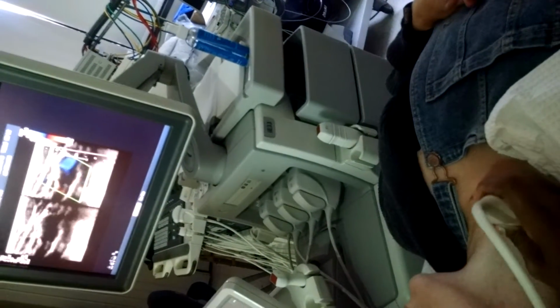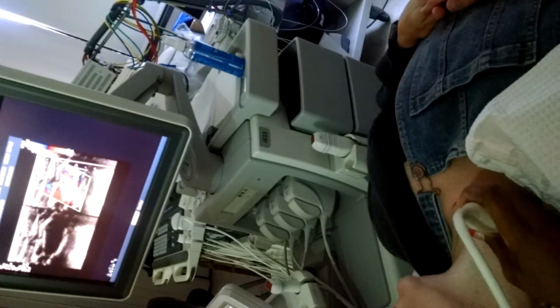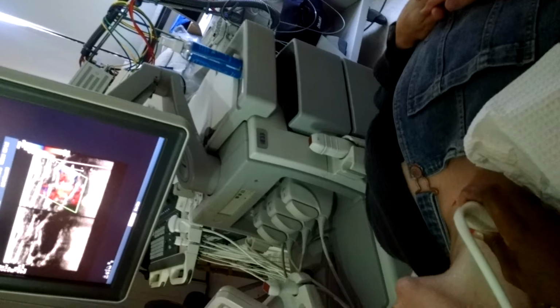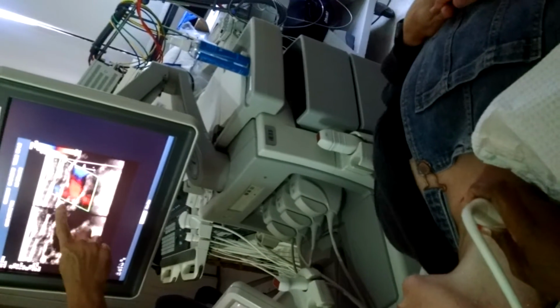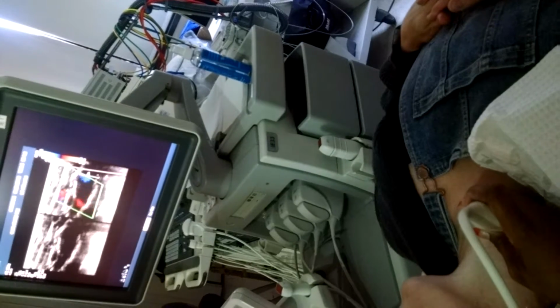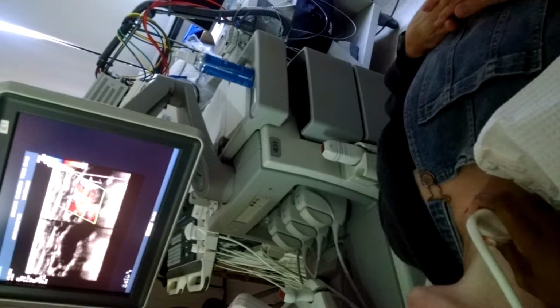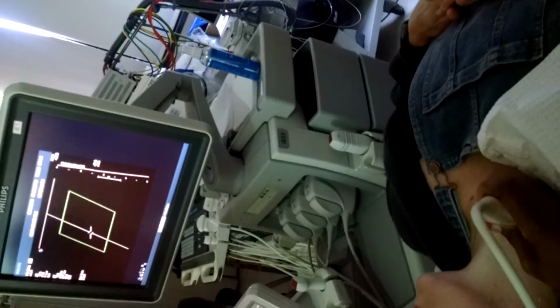Yeah, there's the subclavian. See how it's aliasing because it's a higher velocity vessel? It's so much bigger. Would I need to change the scale up here? I'm going to bring the scale up. No, the CCA will be over here shooting off. So I'm going to put that. Okay, I see.